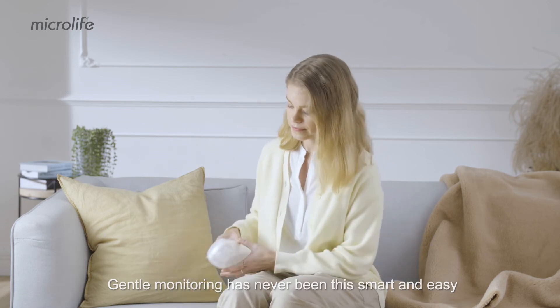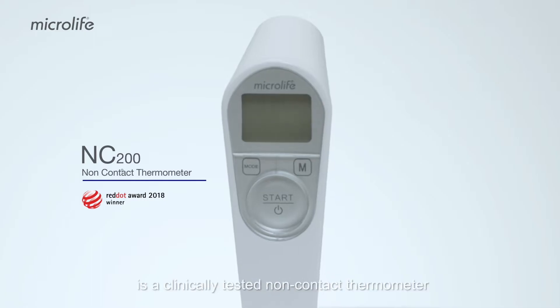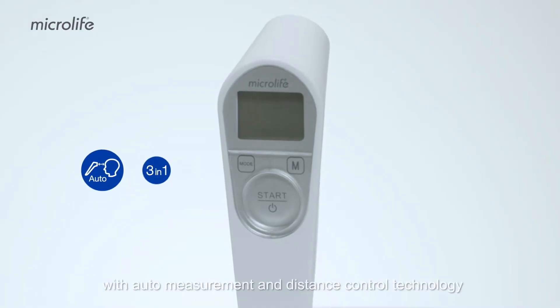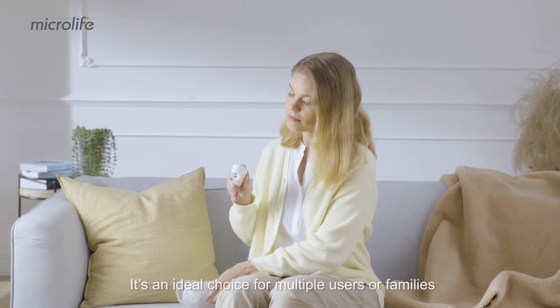Gentle monitoring has never been this smart and easy. The Microlife NC200 is a clinically tested non-contact thermometer with auto-measurement and distance control technology. It's an ideal choice for multiple users or families.